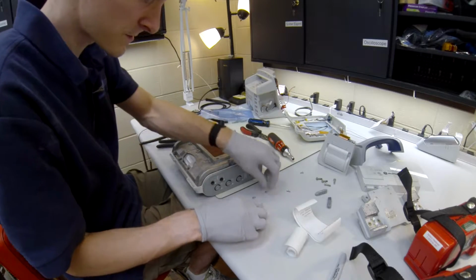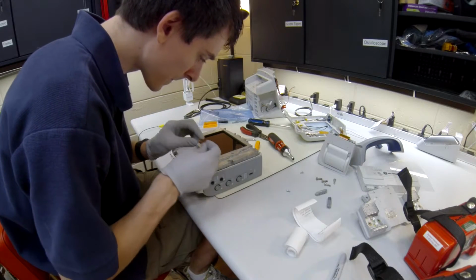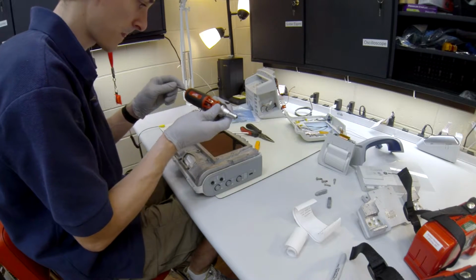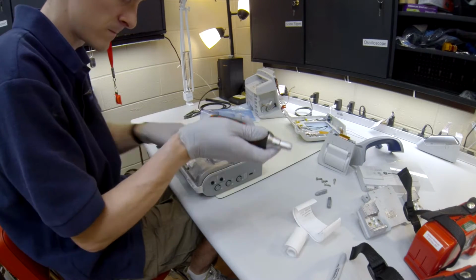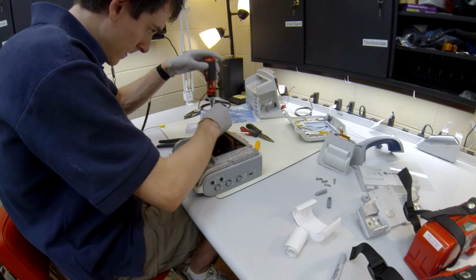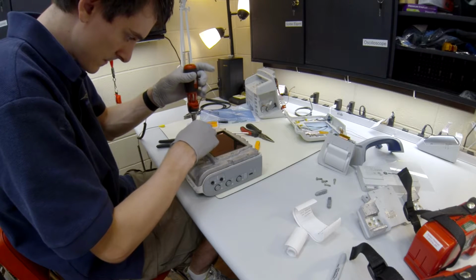Alright, let's do the face plate now, put all the screws back in there. So there's 1, 2, 3, 4, 5, 6, and 7 screws. Let's do this is faster than what I thought it was going to be. Okay. And yes, I do know I need to look at my torque values.